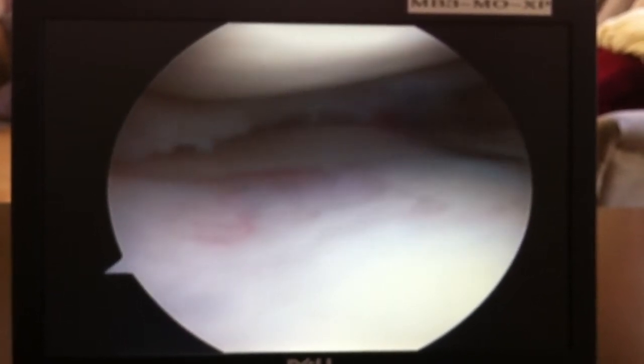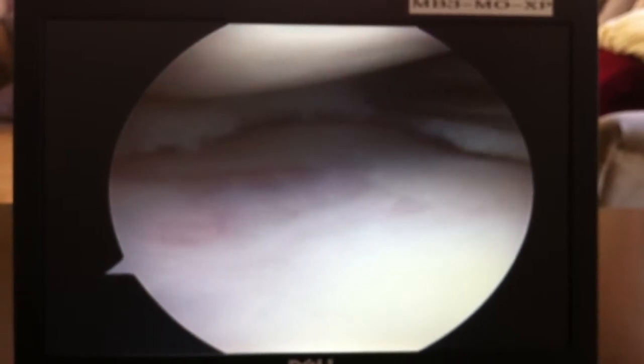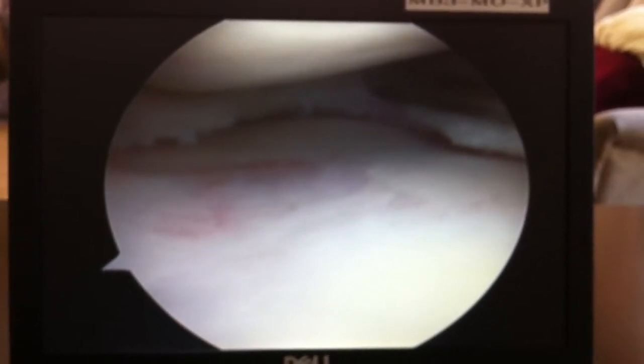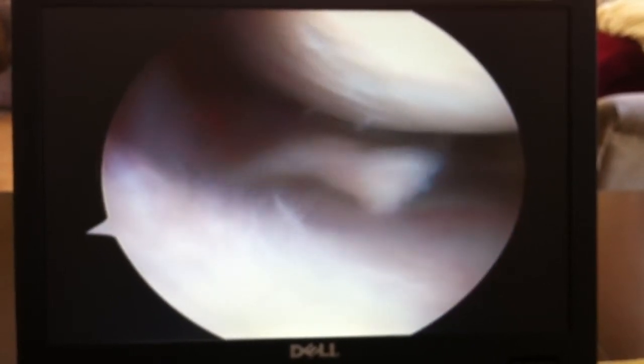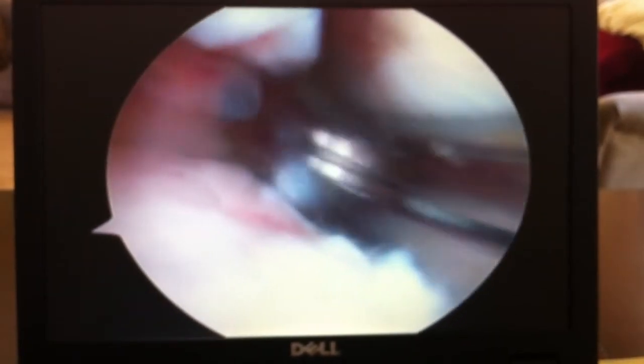Let's save as much meniscus as we can — just take out the torn pieces. You can see how those pieces flipped all the way over there like that. Let's get that piece out.